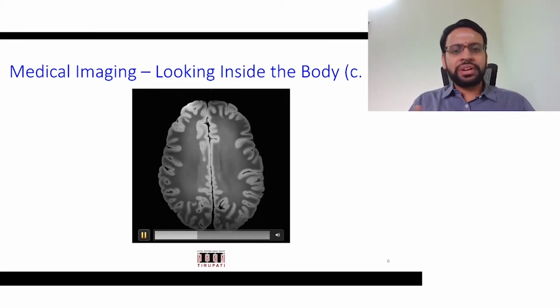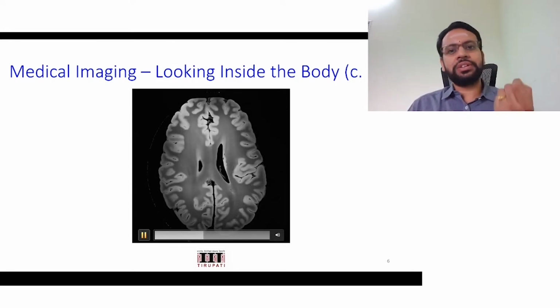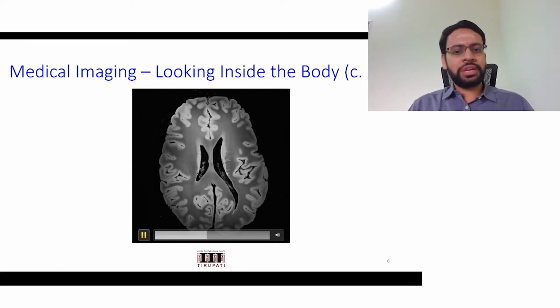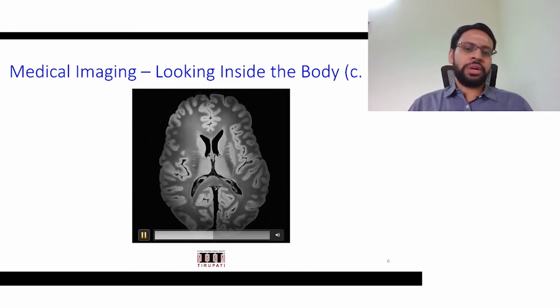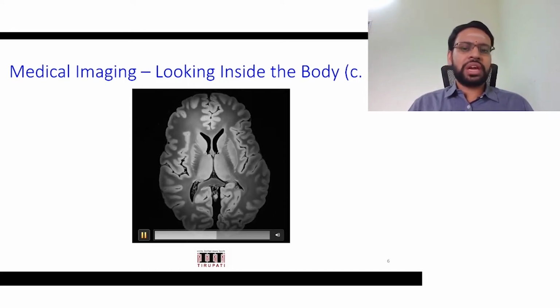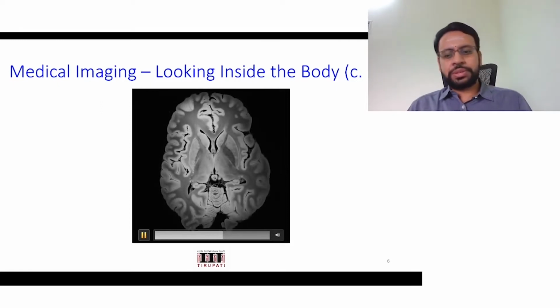And even for our routine checkups of MR imaging, you would get resolutions of the order of millimeters very comfortably, 1 mm, 0.5 mm. These are quite common resolutions that you would get with MR imaging. So that's the kind of advancements that have happened over the years.